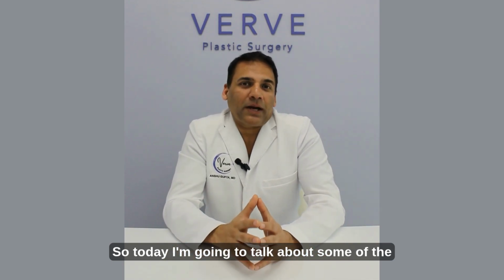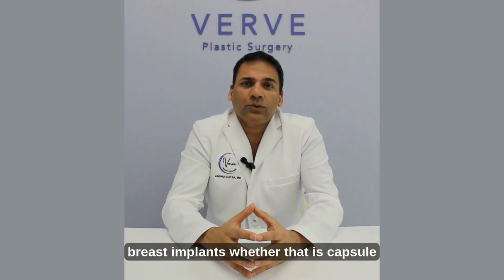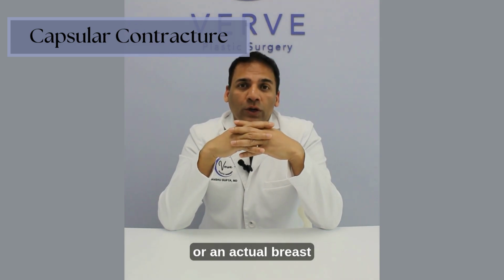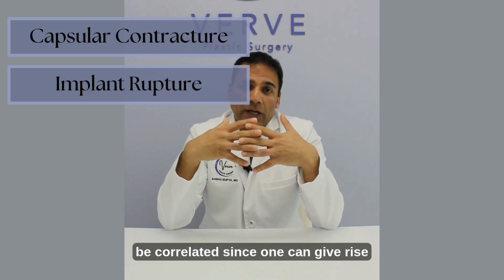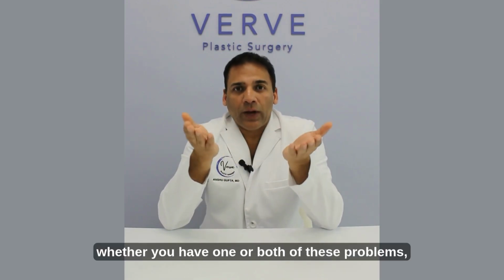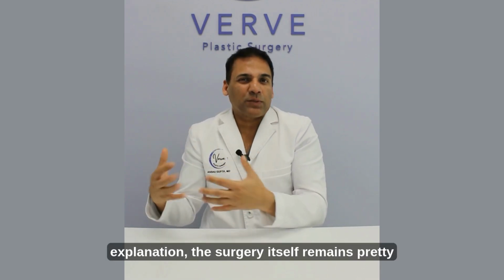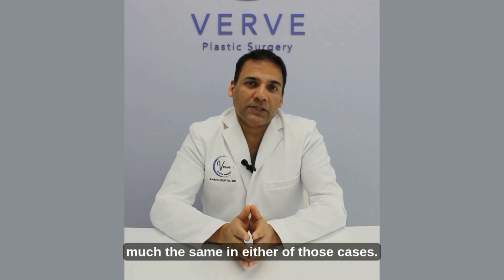So today I'm going to talk about some of the, I would say, late complications of breast implants, whether that is capsule contracture, which is firmness of the scar tissue around the implant, or an actual breast implant rupture. These can be correlated since one can give rise to the other problem. But whether you have one or both of these problems, the following information will still be useful for you, since the solution, the explanation, the surgery itself remains pretty much the same in either of those cases.